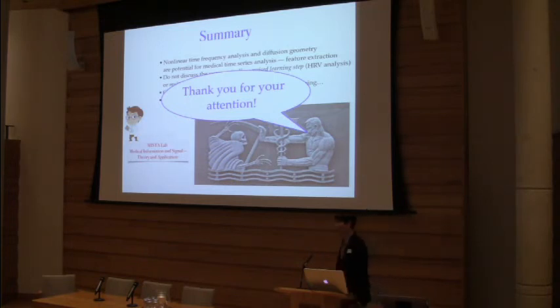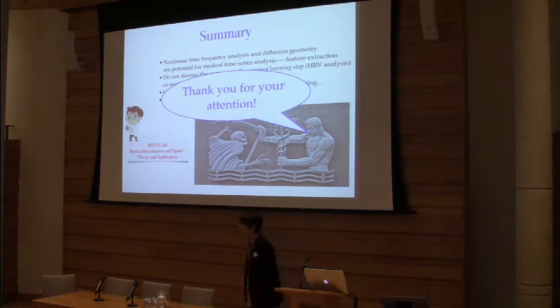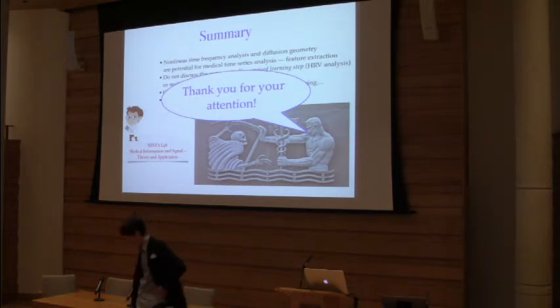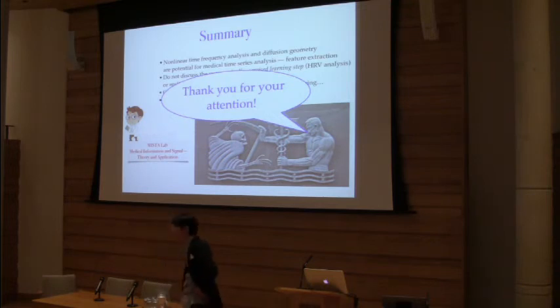Does your technique work in real time? And what is the time delay to produce fetal output? Yes, it can be run in real time. The delay depends on the window you choose. For example, if the window I choose is about 5 seconds, then the delay will be 2.5 seconds.